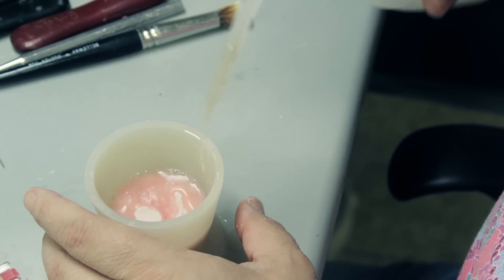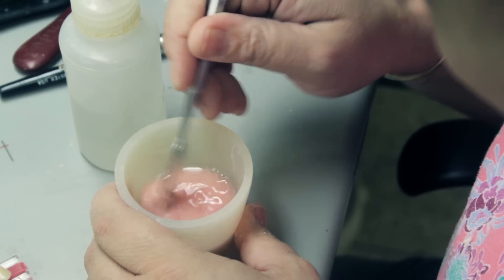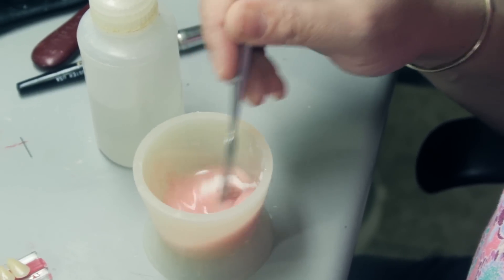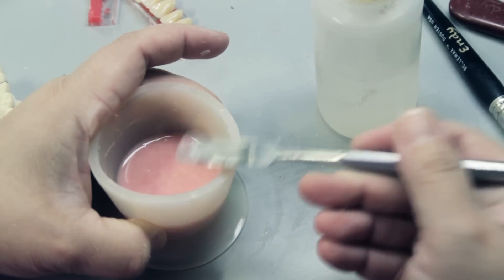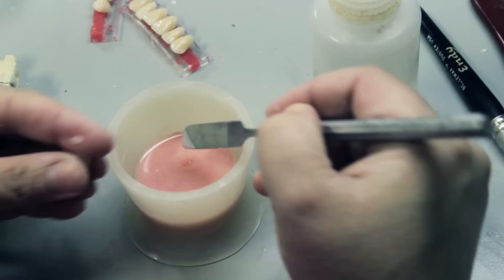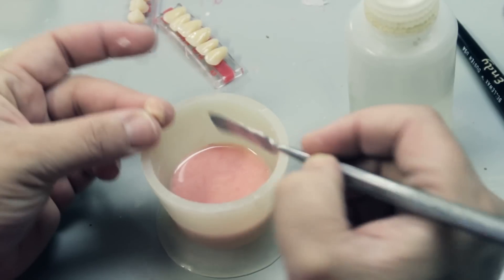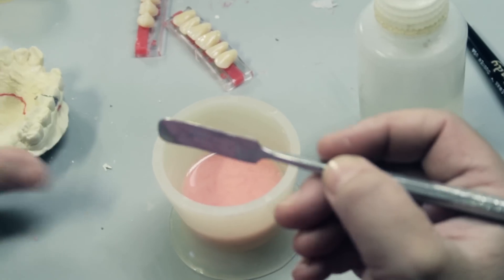I'm now going to mix the acrylic. This acrylic has a special powder-to-monomer ratio. This acrylic will start to cure as it's being worked with. Right now it's runny, but as we go along it will get thicker. I'm now going to fill my retentive hole in my tooth. This will also aid in the bonding.